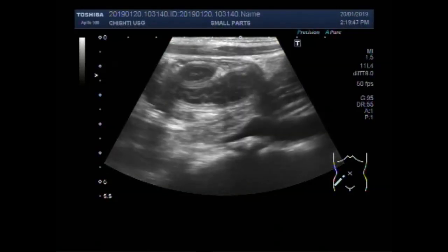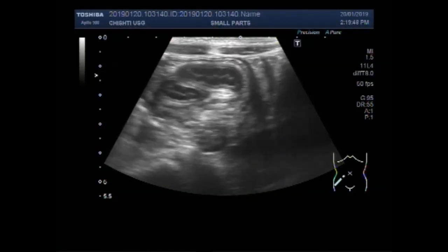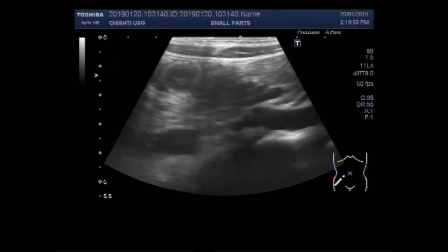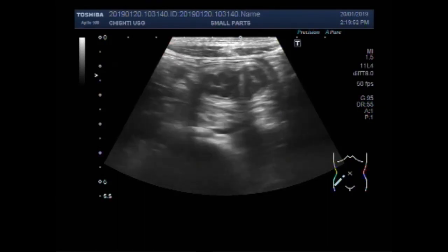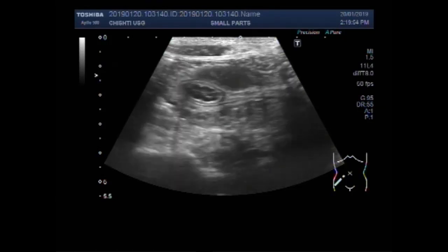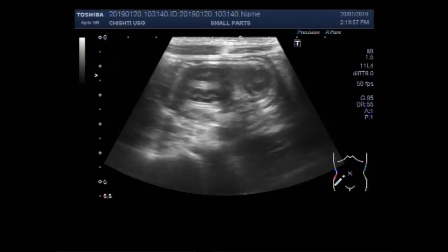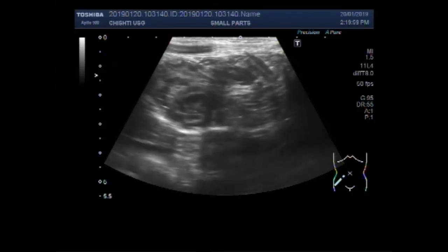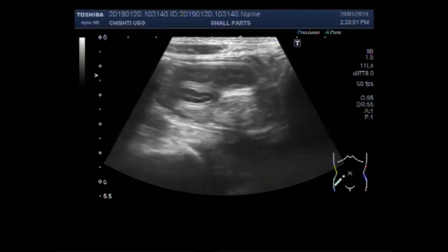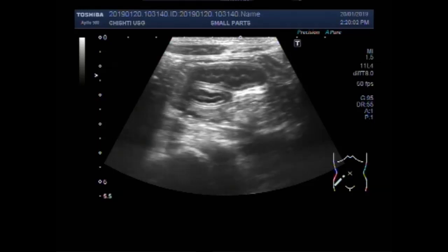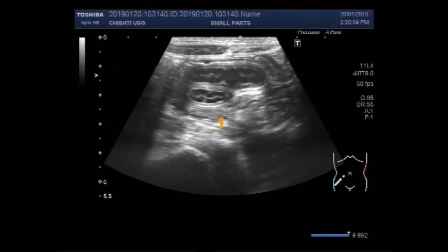Dear viewers, I hope you are all fine. This ultrasound video shows an inflamed gut loop in the right iliac fossa with enlarged mesenteric lymph nodes. The age of the patient is 8 years. You can see the inflamed gut loop.